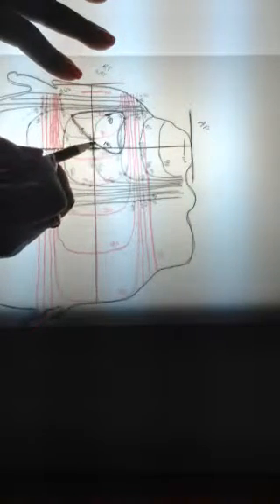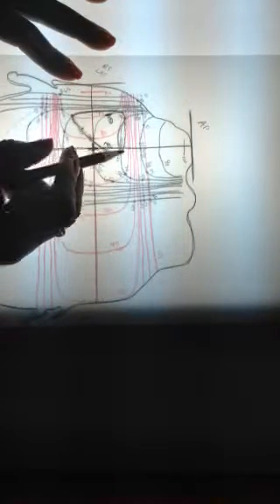Once you start connecting dose points, it might be a good idea to trace another contour like I've done with this one, and just begin to place one solid line that would represent each dose value. So for example, the 140 that we were working with, here are those points.